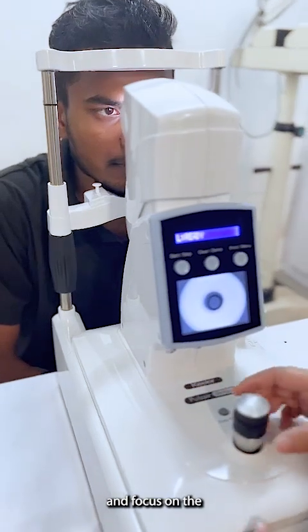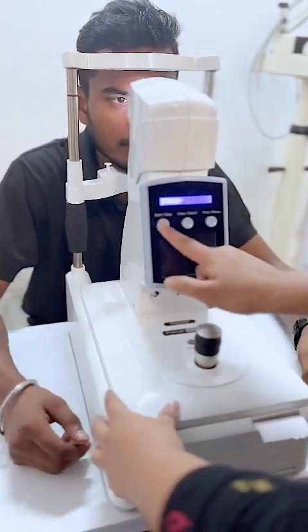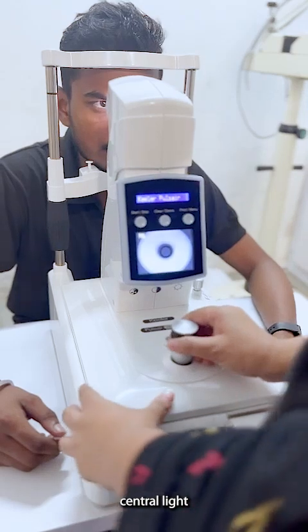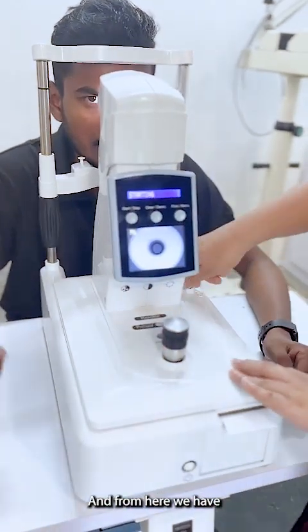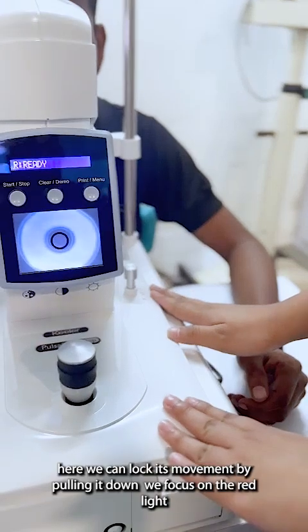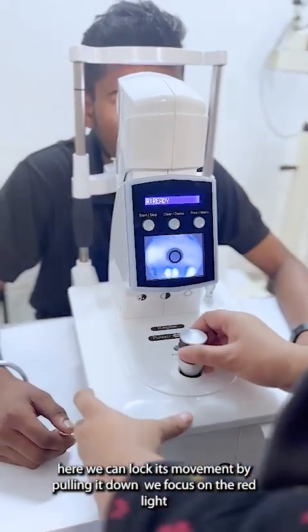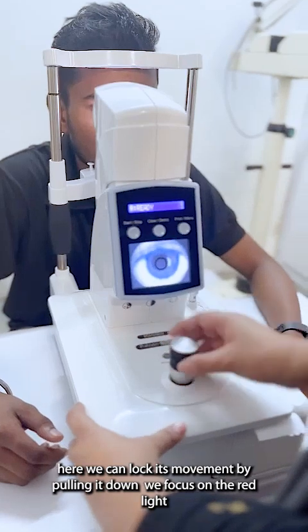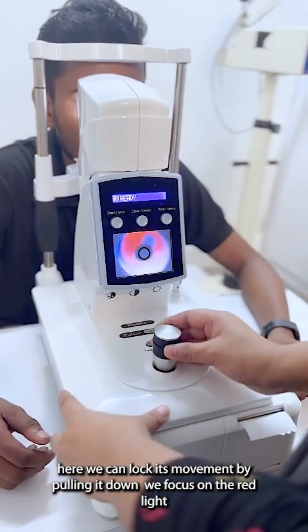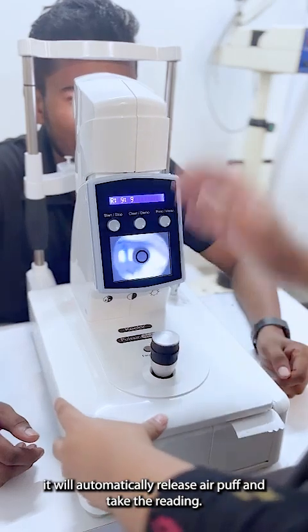The patient should focus on the central light. From here we have to open the movement — it was locked before. By pulling it all the way up, we focus on the red light and it will automatically give the puff and take the reading.